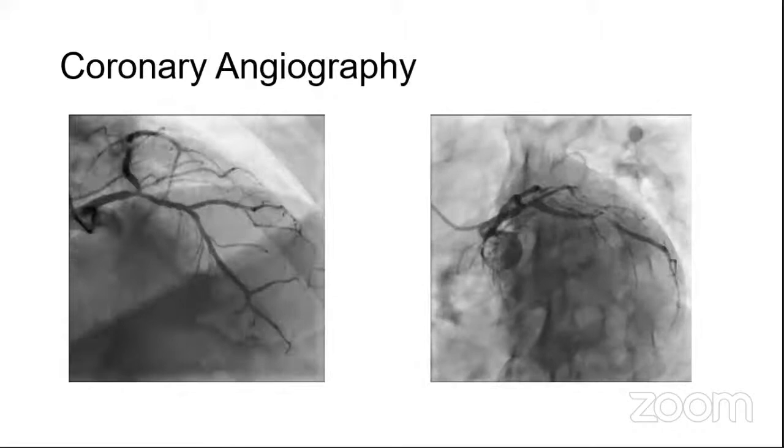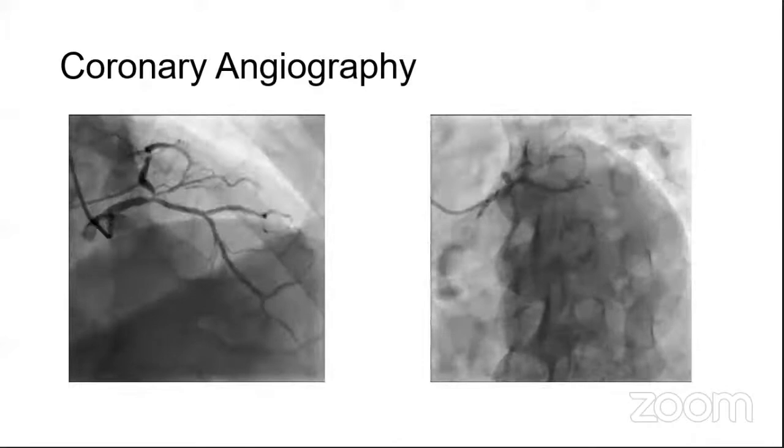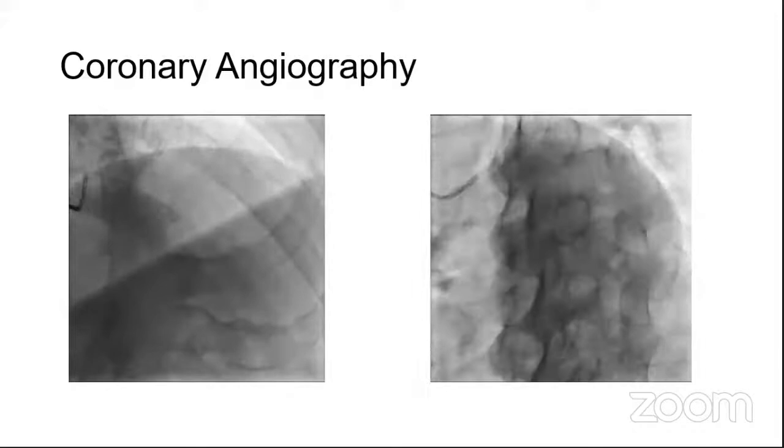All right, so currently you have on the left-hand side the cranial view. Now on the cranial view, you can see that the left main ostial LAD looks a bit hazy. In terms of diameter stenosis, it doesn't look too bad, but it definitely looks hazy. On the spider view on the right-hand panel, the ostium of the circ looks probably tight, and there's also a further proximal to mid circumflex lesion as well.